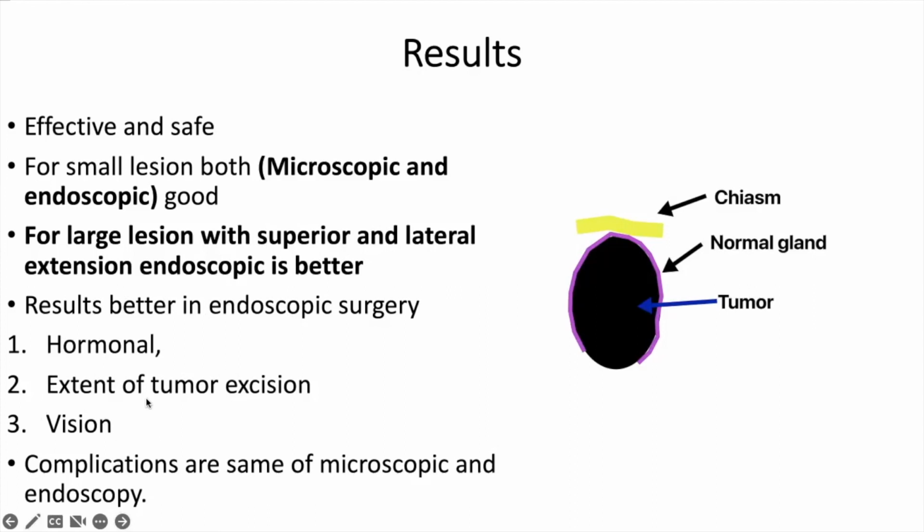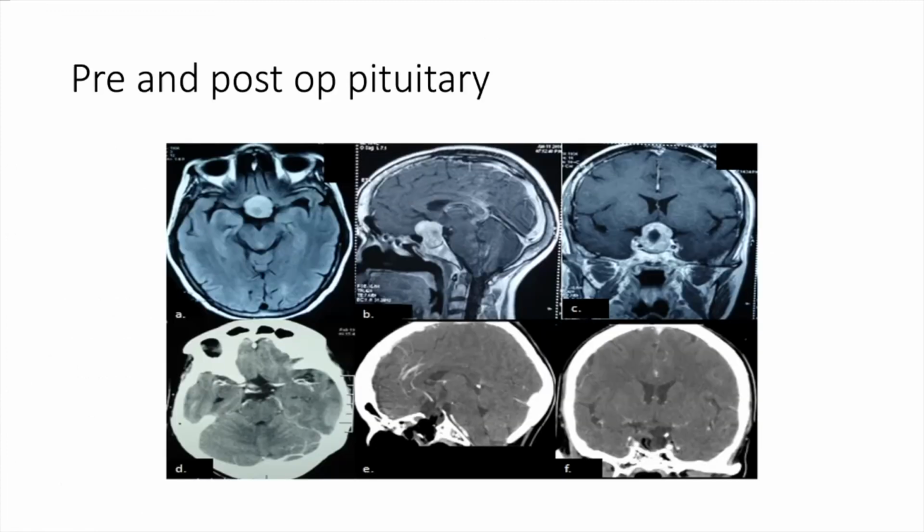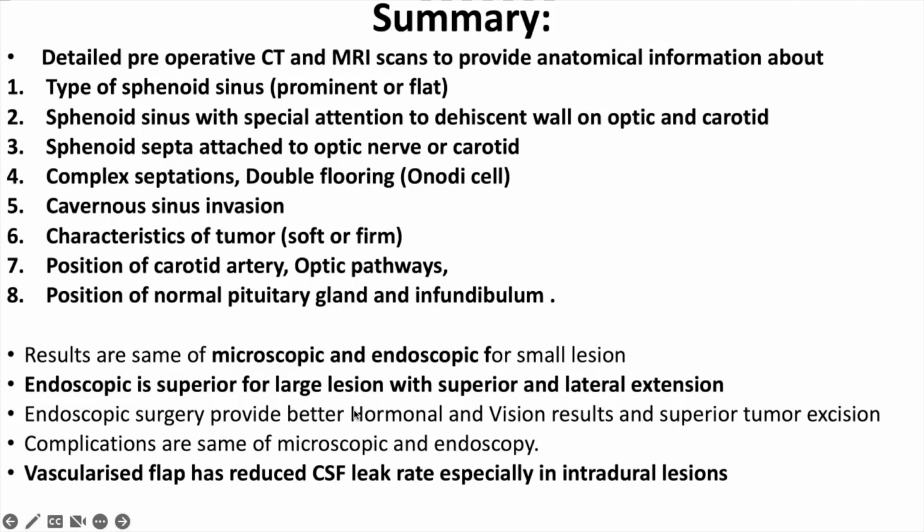The visual outcome is also better, especially when the lesion is large. But the complications of microsurgery and endoscopic surgery in large studies, including meta-analysis, are the same. This is one preoperative imaging and the postoperative imaging showing complete tumor excision.